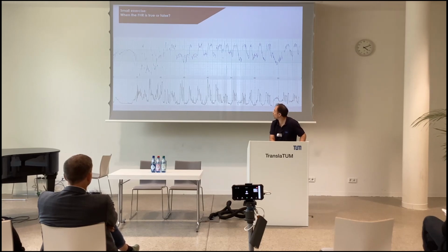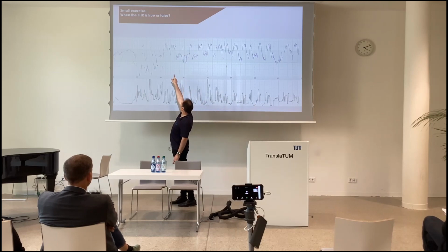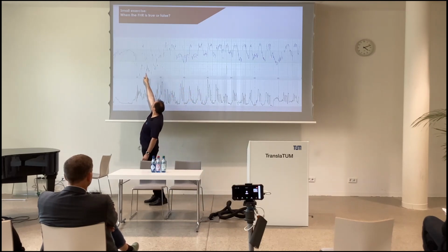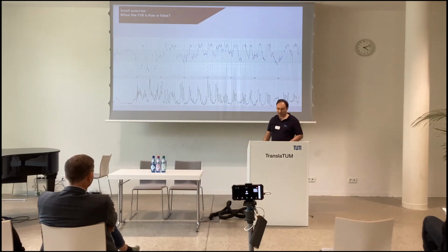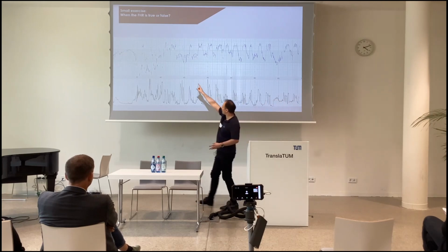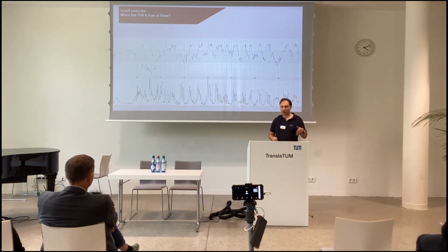This is also some MHR values. And just at the top, not tall enough, there is a small part which is in fact the harmonics of the fetal heart rate, which is 2 times the fetal, which is due to the autocorrelation algorithm used in the CTG monitor to compute the heart rate.